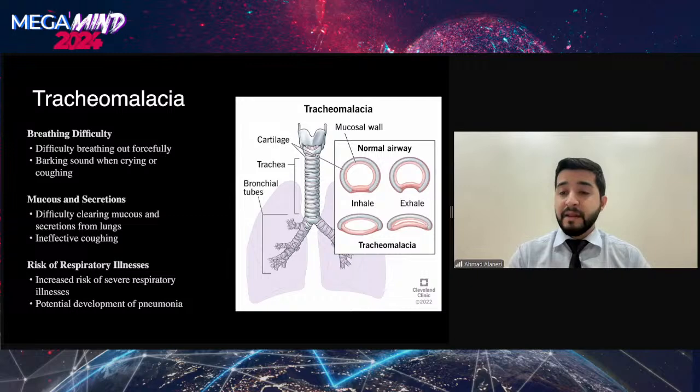The patient reported that his previous denture accumulated mucus and gave him coughing attacks, which sometimes developed into respiratory illnesses and pneumonia. So we wanted to know how good a candidate the patient is for a complete denture, because it's also one of the main things we rely on when rehabilitating an edentulous arch.